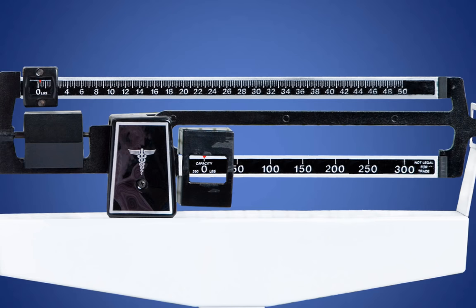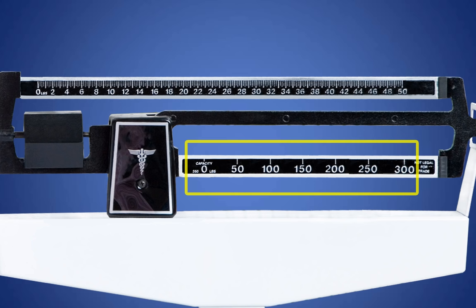Now that you have a general concept of how the scale works, we will now focus on interpreting the calibration markings on the upper and lower poise bars of the balance beam. The lower bar markings increase in increments of 50 pounds. You have 0, 50, 100, and so on.